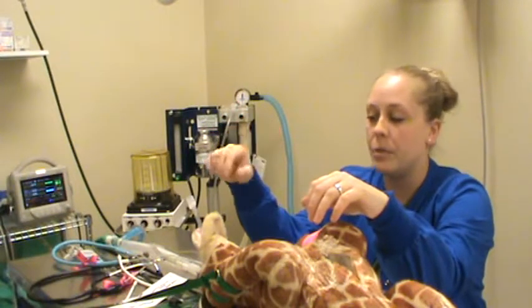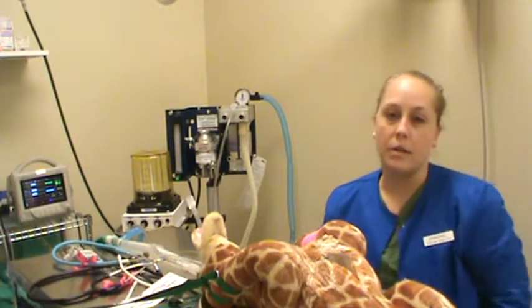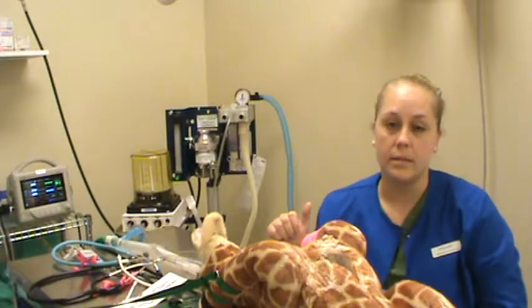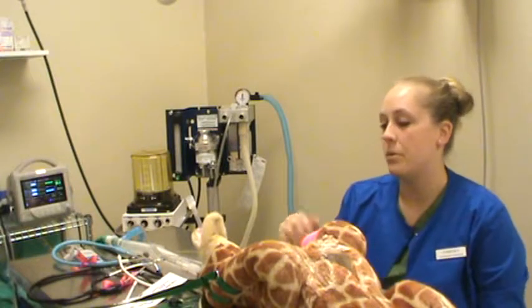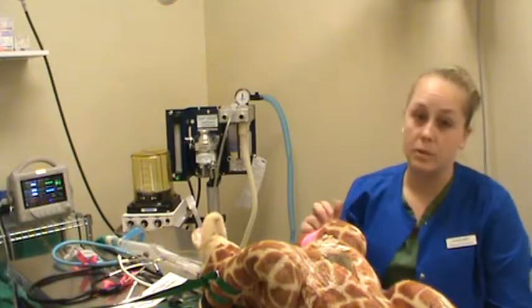The second part of the video, we're going to go over the stages and planes of anesthesia, and how they pertain to the reflexes that you're going to see in your patient, regarding how light under anesthesia they are and how deep under anesthesia they are. So going ahead, the first part we're going to explain is all of our monitoring equipment.